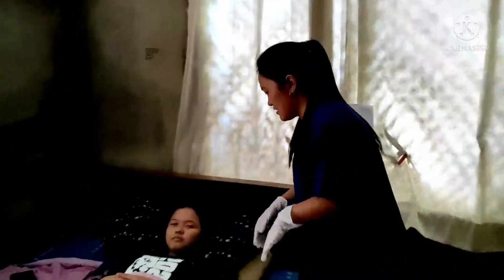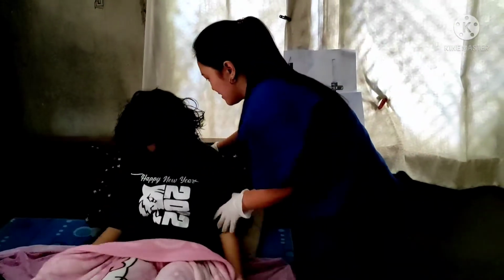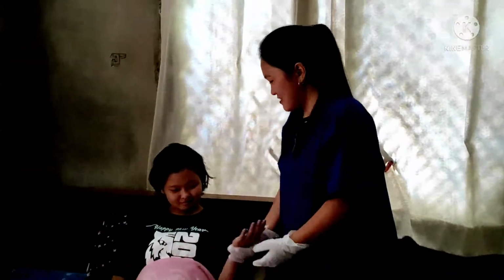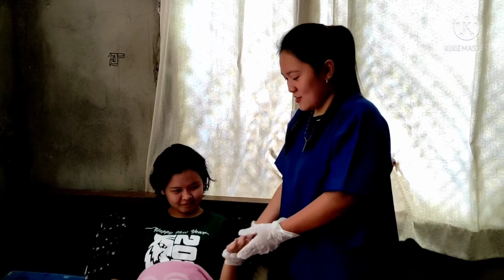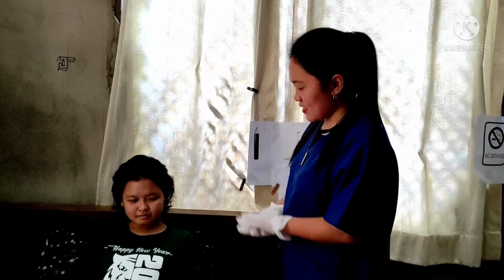Assess the client into a high Fowler's position. And then explain the procedure to the client. So, ma'am, I'm Gigilin Velasco, your student caregiver for today. Can you state your name, please? Yes, Velasco. When is your birthday? August 26. Okay, thank you, ma'am. I'm going to give oxygen administration to you. Is that okay with you, ma'am? Okay, thank you.